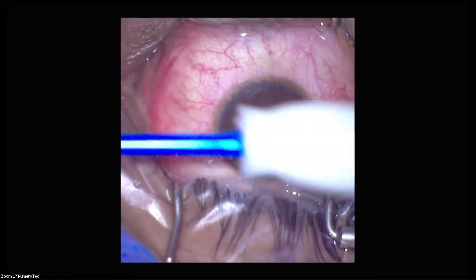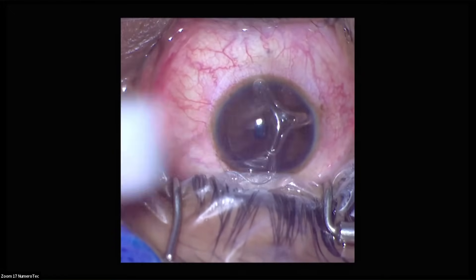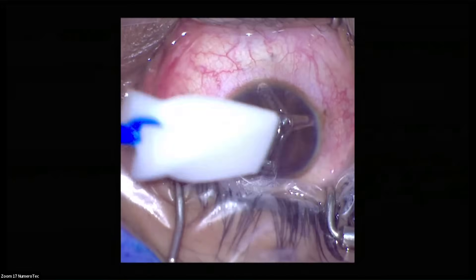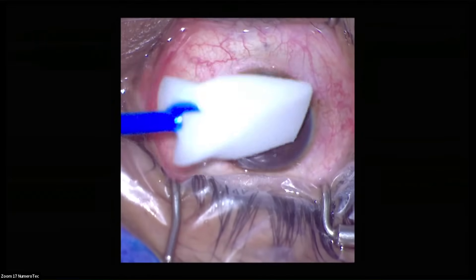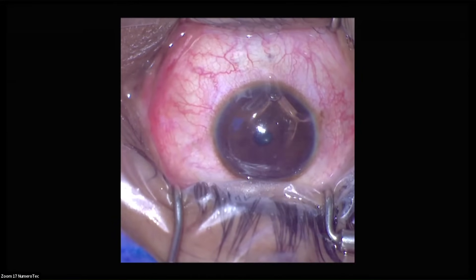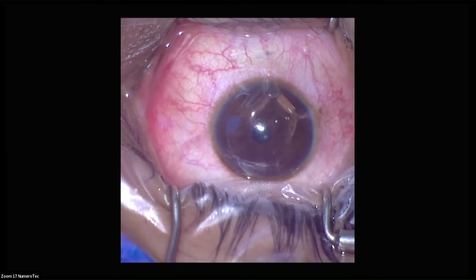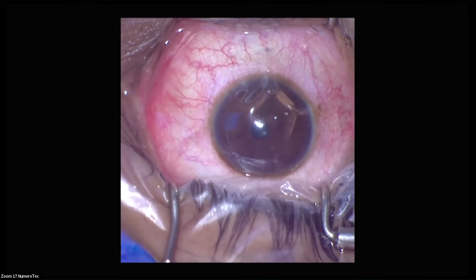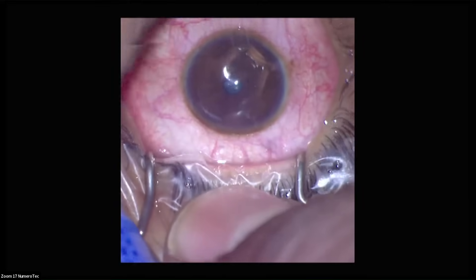So what you mean is when you're doing the anterior dissection, you go up to the edge of the plane, but when doing the posterior, you won't go up to the edge and do it finally. Exactly — because I want the center to be completely dissected before I cut the edge, because if I go inferior and cut like I cut superiorly, the lenticule might fold over before the dissection is complete, and then you won't know how much of the dissection is complete.